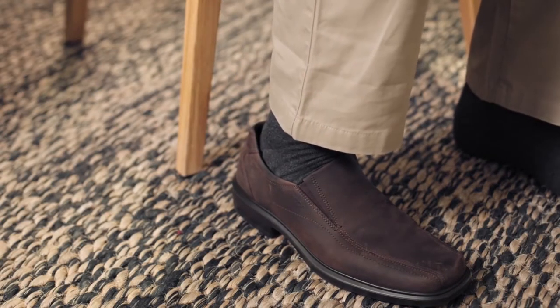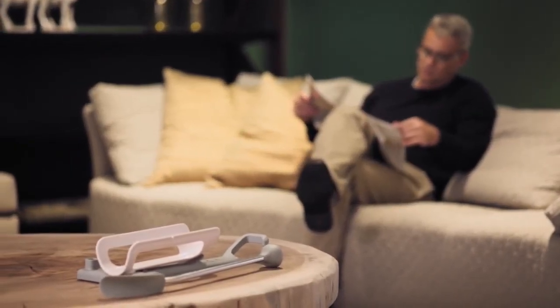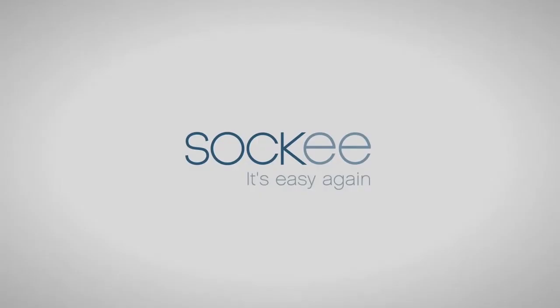Well, that's easy! Thanks to Socky, you've performed this daily task with no overexertion. Socky, the revolutionary solution that empowers you to get up and get going every day. Socky, it's easy again!